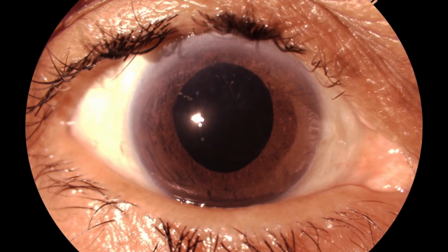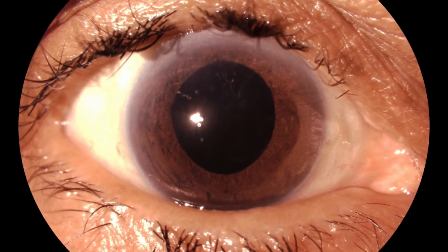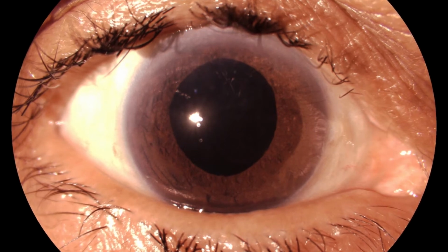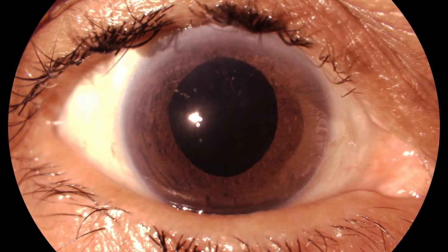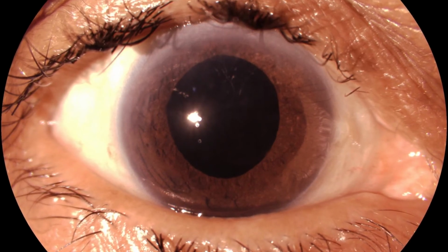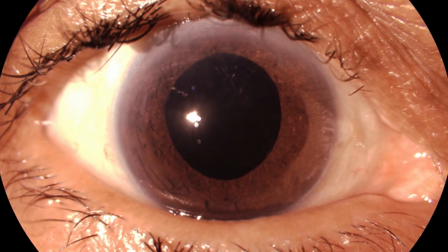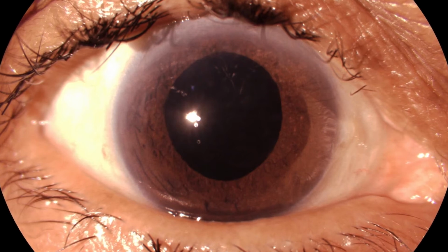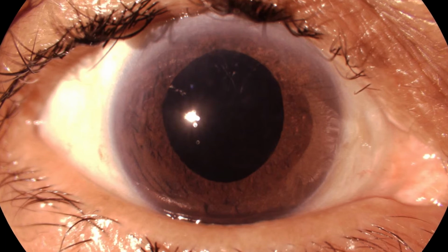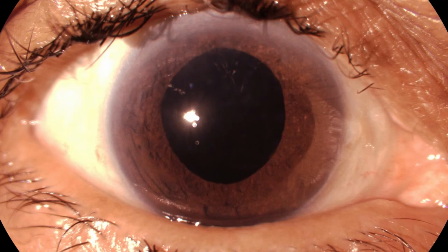Adequate anterior vitrectomy has been done, so there is no vitreous prolapse through the anterior chamber, and the patient requires an IOL implantation. Now there are a few choices here. One of them can be angle fixated, another can be iris fixated, either anterior to the iris or on the posterior surface of the iris, and then there can be scleral fixated IOLs which range from glued IOL to no glue IOL, that is, the haptics are tucked into the tunnel, and those IOLs which are held in place by using sutures.